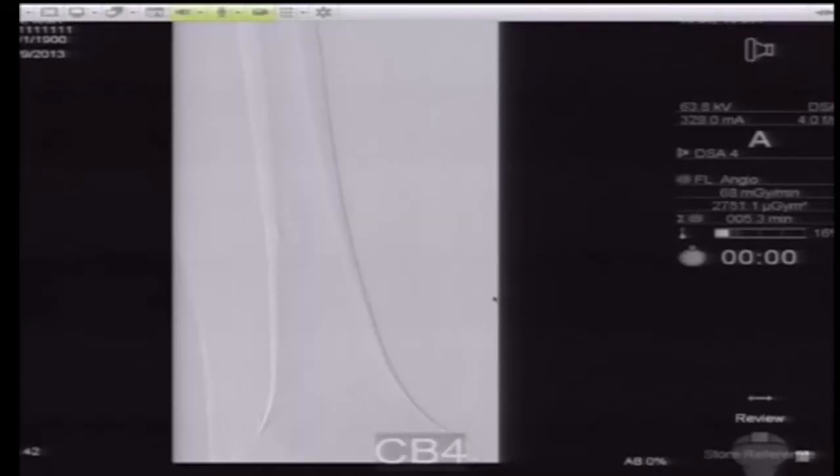What he's going to do is reinject dye to see how far down the blockage extends. Then you've got to make a decision about whether this is something we can open with a catheter or whether we have to do a bypass. He's going to inject more dye — you'll see all the little collaterals come down and then fill basically the obstruction, showing distal to the blockage. These are the little collaterals that have come down — this is the blockage, and it keeps the distal part open because of all these little branches.